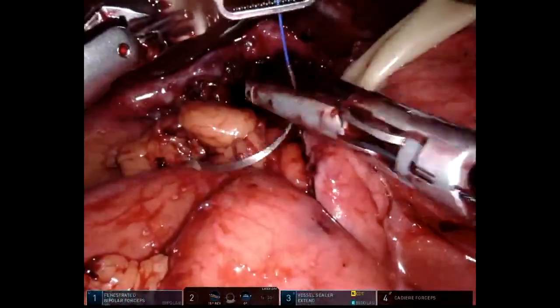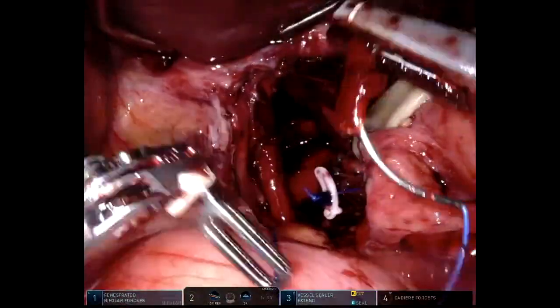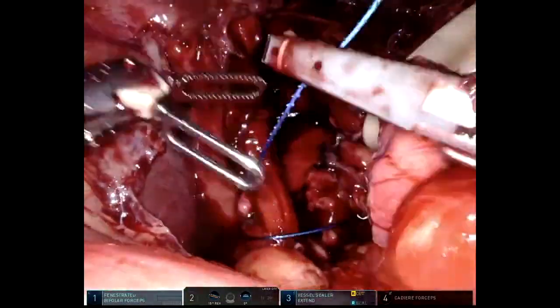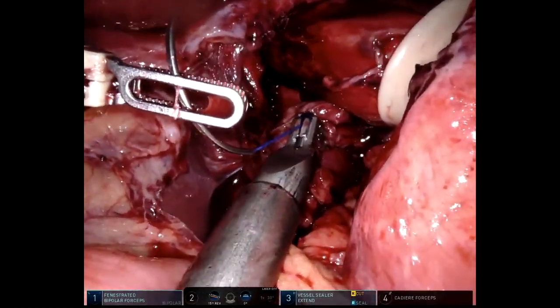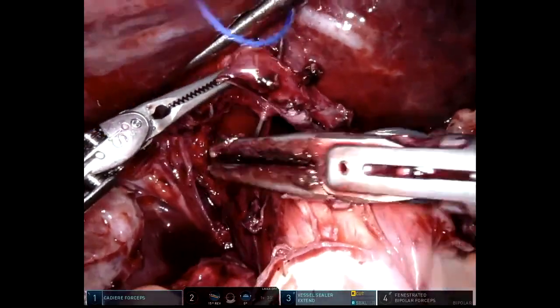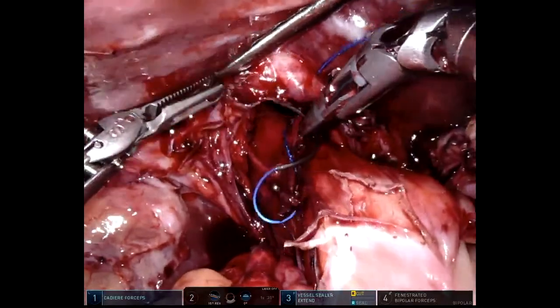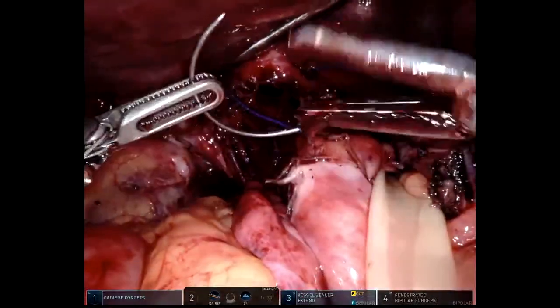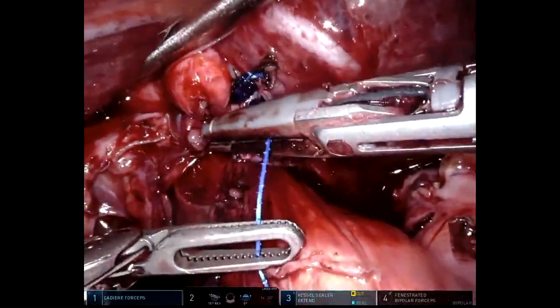At this point we start re-approximating the hiatus utilizing the zero V-lock suture in a running manner. An additional suture is placed anteriorly to prevent any abnormal kinking of the esophagus from utilizing only the posterior crural closure or only the anterior crural closure. You can see there is a relatively snug closure without overdoing it, to minimize the risk of dysphagia.